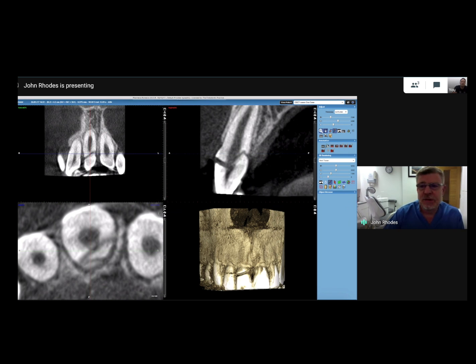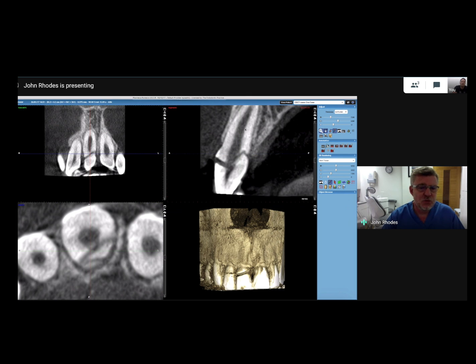The other thing is resorption. If you get inflammatory resorption — perhaps the tooth hasn't been root filled soon after the trauma — this can destroy the root. Again, you won't see that on a radiograph. So it's really key in trauma cases, especially if the trauma isn't recent, to take a CBCT to check for those two things, because it will have a bearing on your treatment outcome.